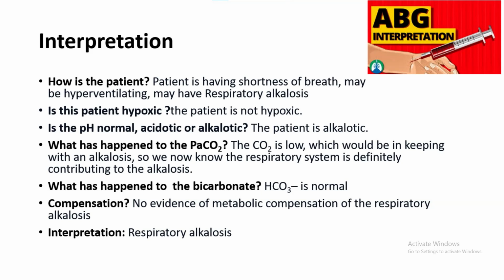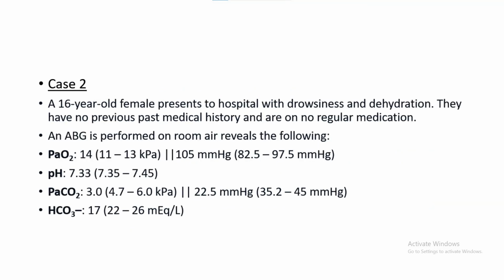Interpretation: respiratory alkalosis. Case 2. A 16-year-old female presents to hospital with drowsiness and dehydration. She has no previous past medical history and is on no regular medication.